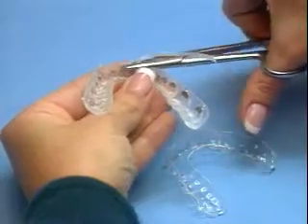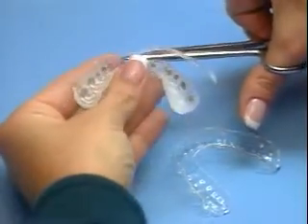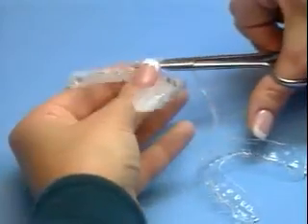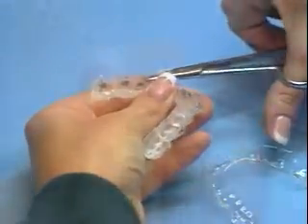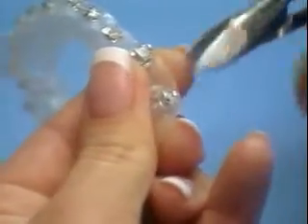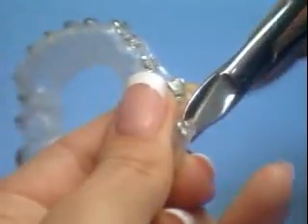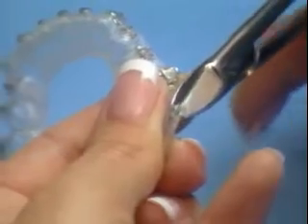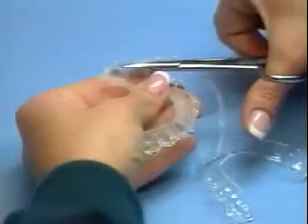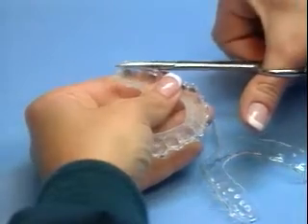In Dr. Sandi's office, the assistants prefer to trim the soft trays individually. However, this can be done by the laboratory technician. Or the two trays can be trimmed together. If there are no hooks, trimming is optional.